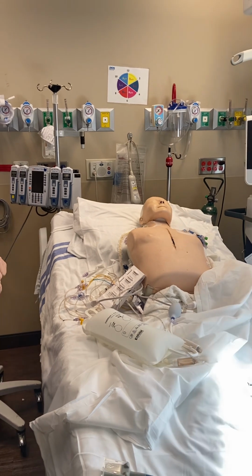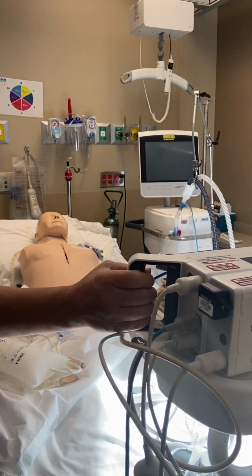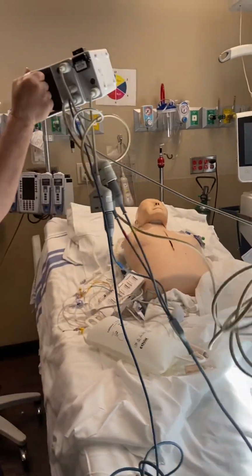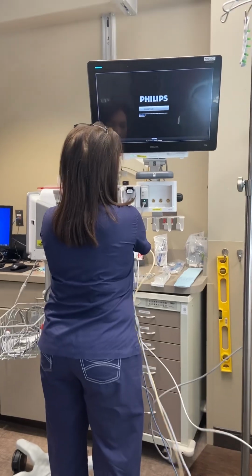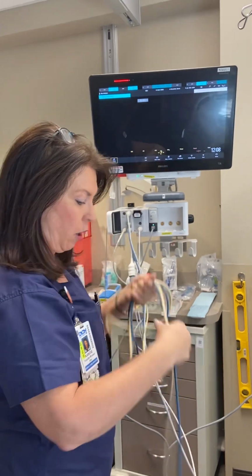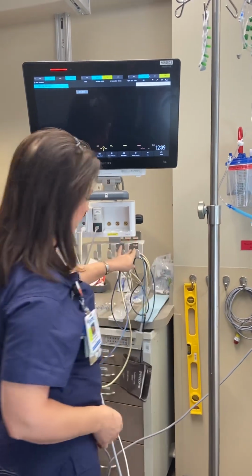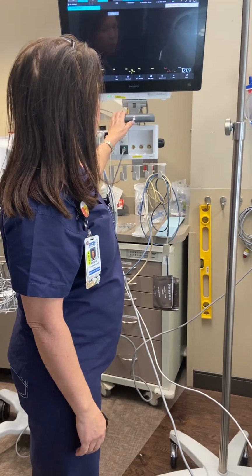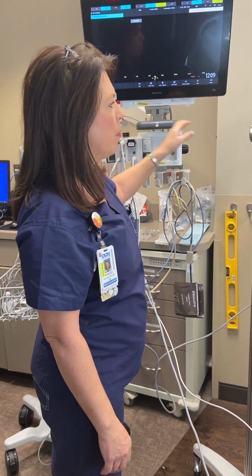So once you pull the covers back and you've freed your lines, you can take the Philips handheld monitor. Once your lines are free, go from here straight to the monitor so that it is one seamless process, so that there is no delay in the monitoring of the patient, okay? Your cords and lines are all kind of jumbled up, and that's just the nature of the beast in trying to get things situated, okay? So once you have that, your patient will come up on your monitor. The primary person will write down the vital signs, and then the secondary person will do the task.